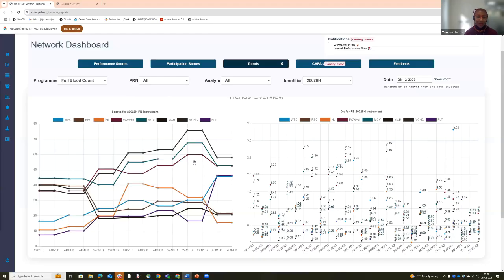I would say I would start to look at things earlier. If my score was trending up towards 80, I'd start to investigate at 80 and before it gets to 100. You could also notice at a glance that it might not be hitting 80 yet, but if you see your score graph going up on that trajectory, I would be looking at that as well, because it should really be fluctuating as you see on the screen here. If you're finding it is going straight up, I would start to look at it even sooner, before it hits 80. It's always best to catch it before we have to write to you.